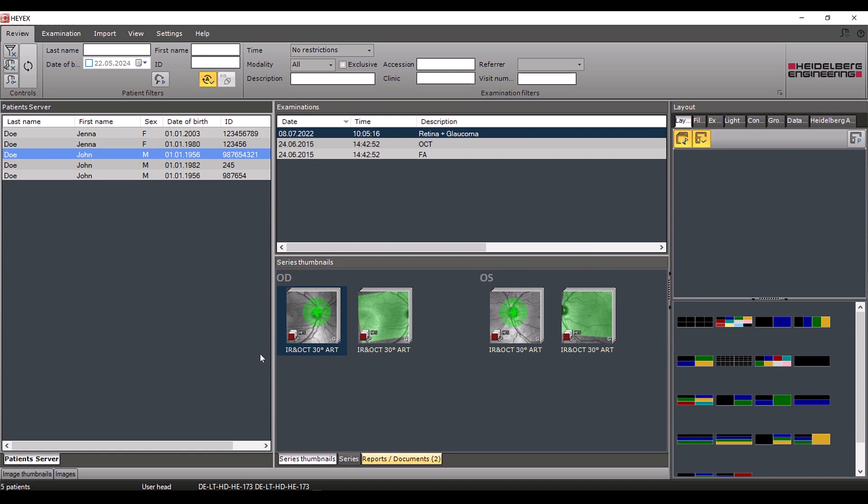If all the master data is identical, the system merges both entries. Again, please wait until the changes are displayed correctly before starting another procedure for this patient.